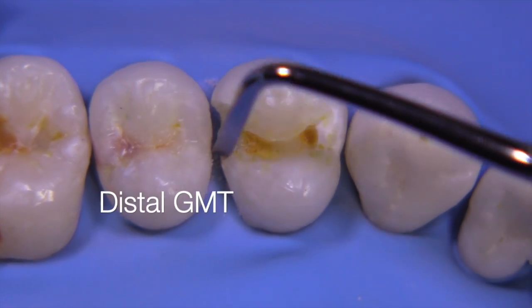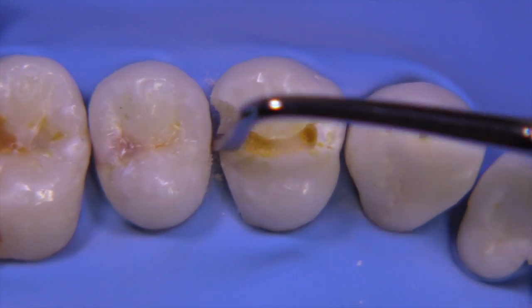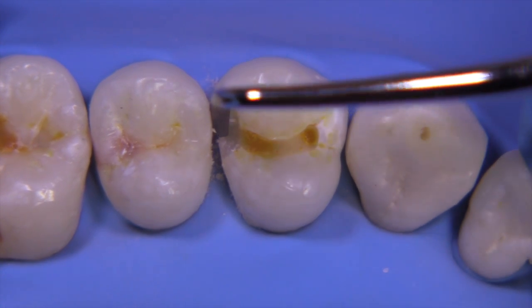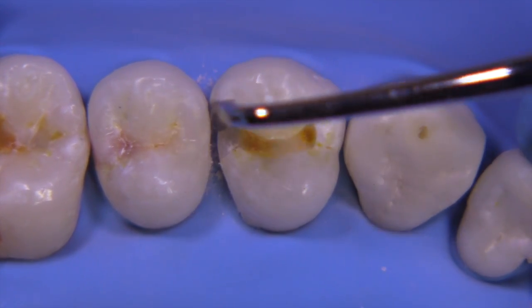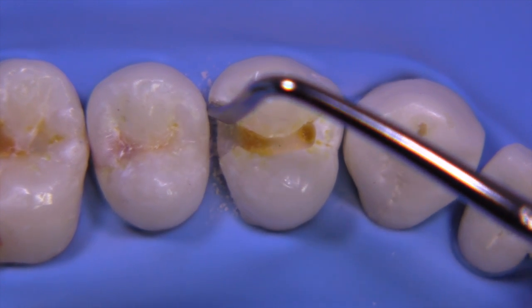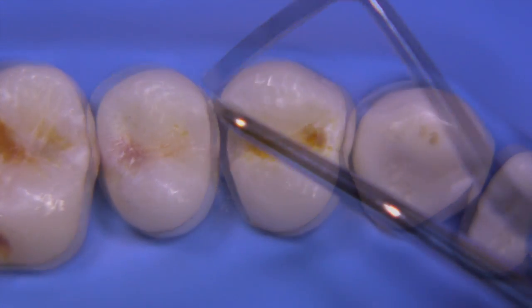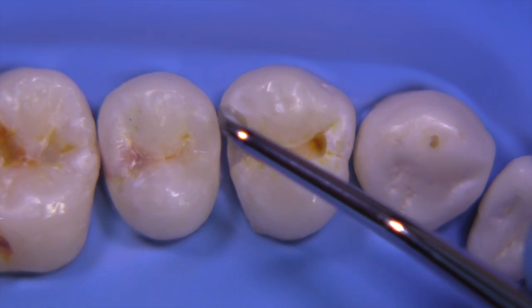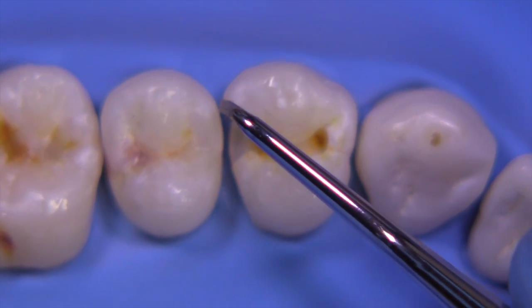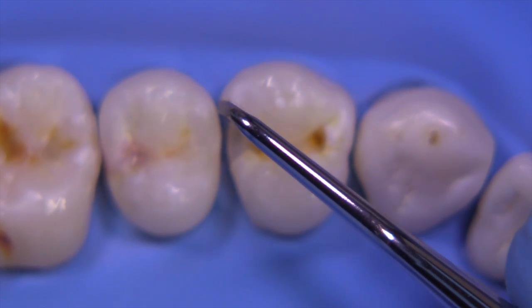You can utilize a gingival margin trimmer — this is a distal GMT — to remove any loose enamel rods at the gingival, and also on the facial and lingual as well. Whatever hand instrument you use, make sure it is really sharp. Going back to the hatchet to try to get more extension; it's not working well, so ultimately we'll go back with the burr and try again with the hatchet.